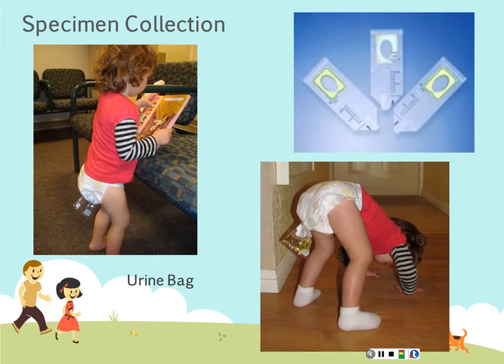One of these things is going to be with a urine bag. Now, a urine bag is frequently used if you need to obtain a specimen collection for a urinalysis, so that would be a clean specimen collection, not sterile. And it would need to be on a child small enough that the urine bag itself and this little stick-on piece is going to encompass the child's whole genitalia.